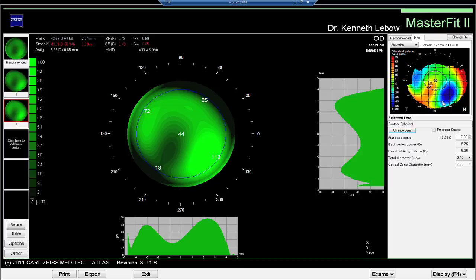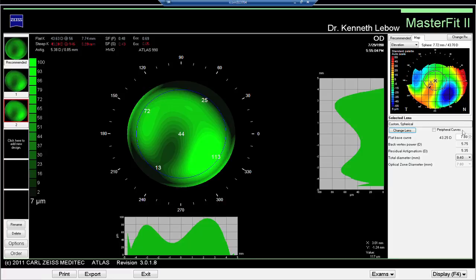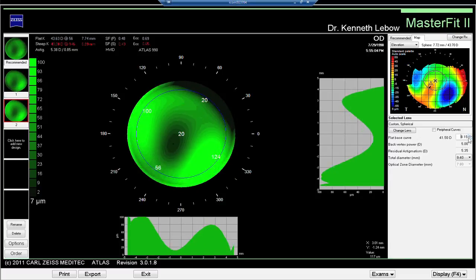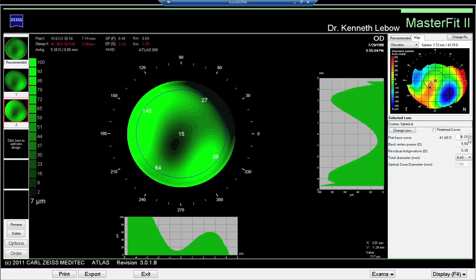Areas in blue are below a reference sphere — in this case a 7.80 millimeter curve — which is why there's pooling. The area in red is elevation above the 7.80 reference sphere, and that's why this area is thinner and has touch. Flattening the curvature by increments of 0.05 millimeters creates more touch in the center and more pooling in either of the two peripheral areas.